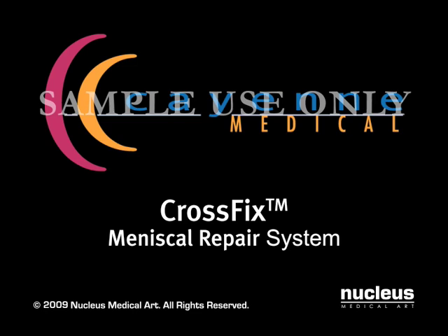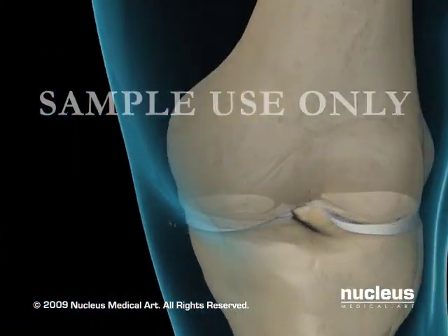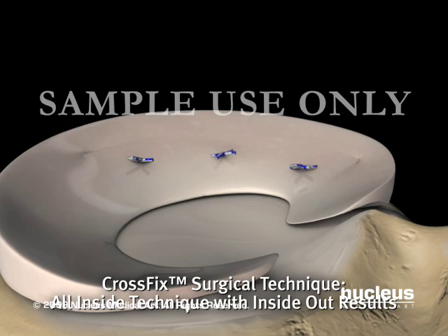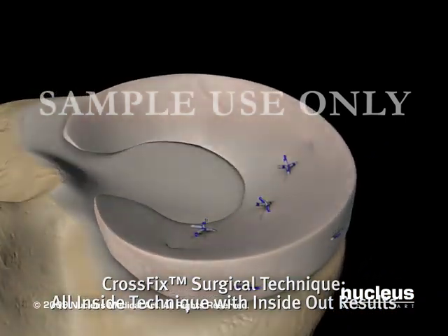Introducing the CrossFix Meniscal Repair System from Cayenne Medical, an innovative approach to meniscal repair featuring a suture-only device that creates an instantaneous mattress stitch for fast, strong, and reliable all-inside meniscal repair.